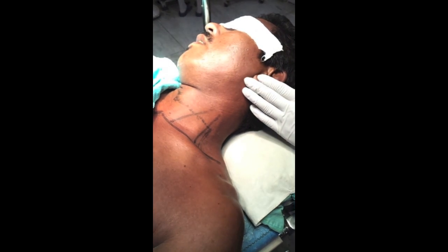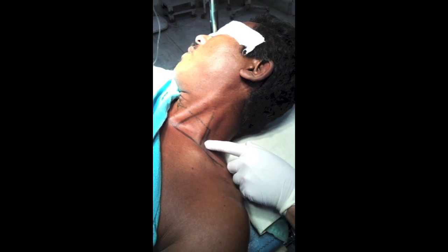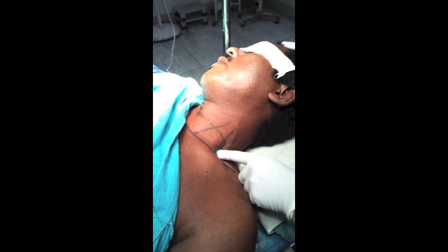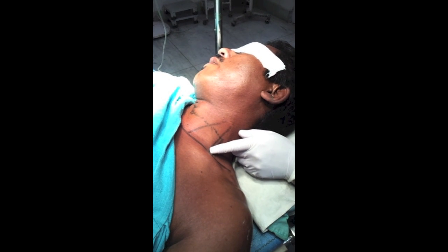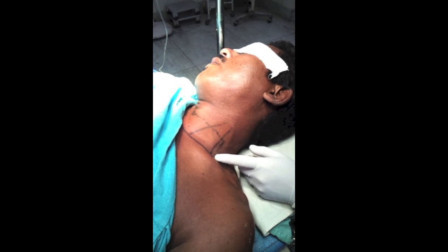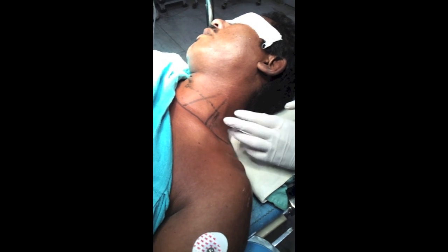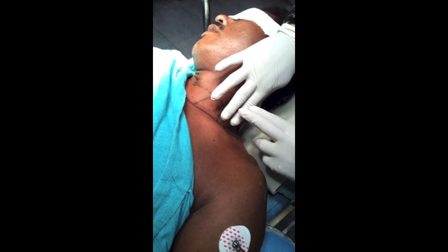To identify the interscalene groove, ask the patient to lift their head. Feel the groove, then ask the patient to sniff — the groove becomes more prominent. The advantage of this technique is that the lung pleura lies here; this is the pleural dome. We are approximately 1.5 to 2 centimeters lateral to the dome of pleura, so there is no chance of pneumothorax at all. Also, the interscalene groove is palpable even in an 80 kg patient, and the brachial plexus roots are sandwiched within this groove.